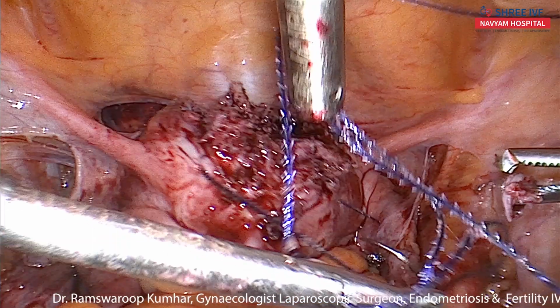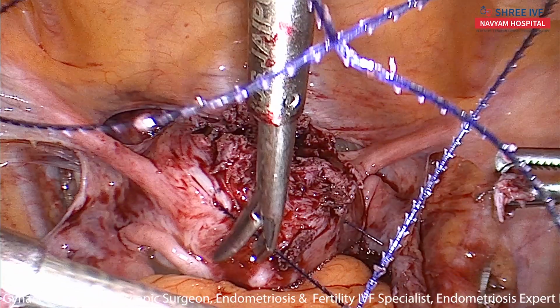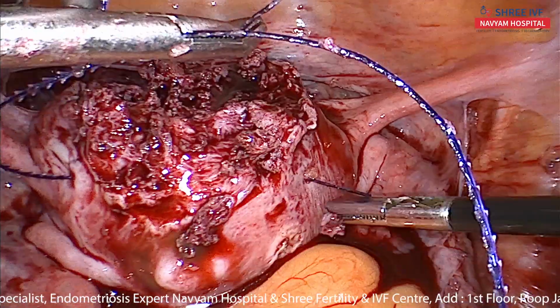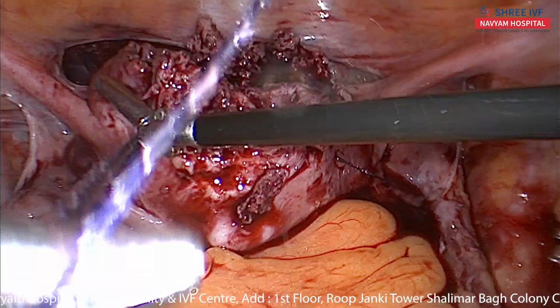This is a 45 centimeter large suture. Knot is broken. Okay.